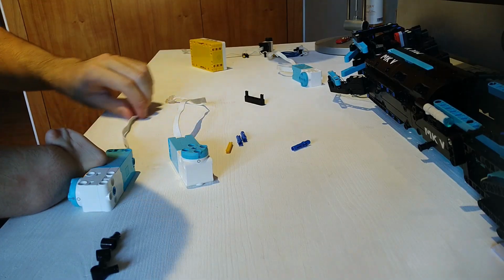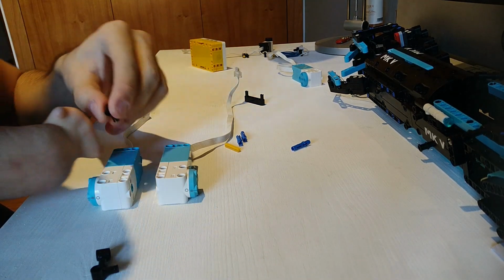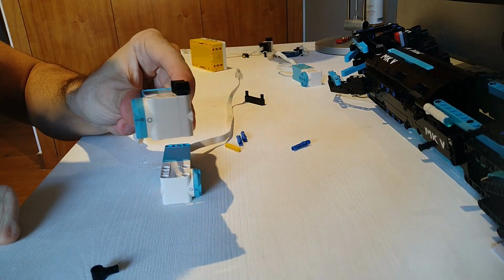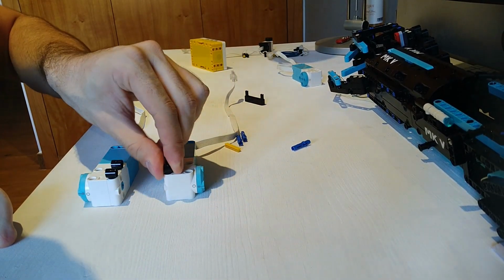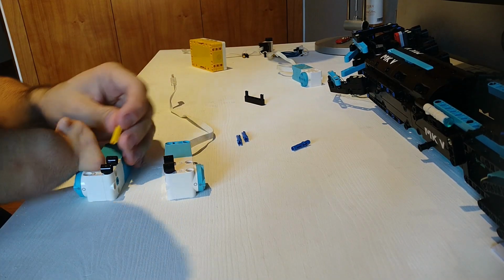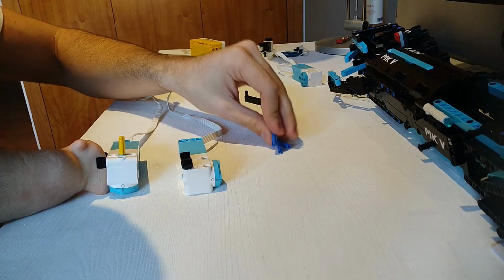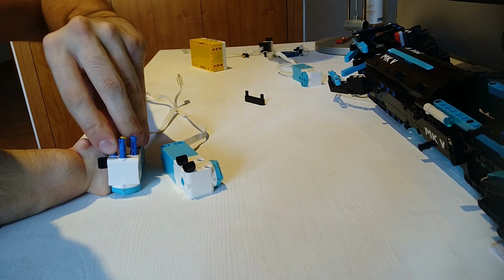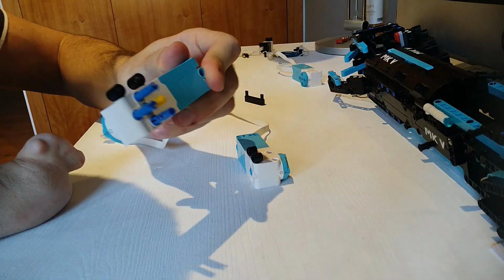First of all, we're going to connect the black pins with holes that we removed from the prosthetic. And we are going to connect them like this, on the white side of each motor. Okay. The next step is to grab the axle and connect the 2 motors from this side. Now you need the 3 pins and connect them to the white part of the motor. So you should have 1 motor with only the black pins and the other one with the black pins and the yellow and blue parts.